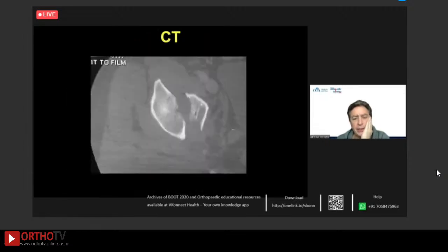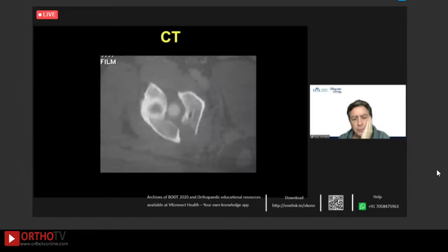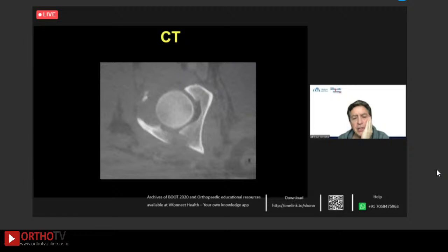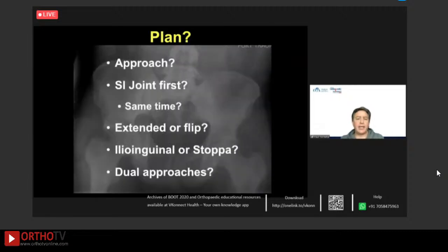So here's the SI joint, and here's your dislocation. I mean, your transverse. So I guess I'd ask, what approach would people use? Do you do the SI joint first, or at the same time? Do you do it extended? Do you flip? Do you do an ilioinguinal or a Stoppa? Dual approaches. What would people pick for this basic transtectal transverse, very oblique, with an SI joint?